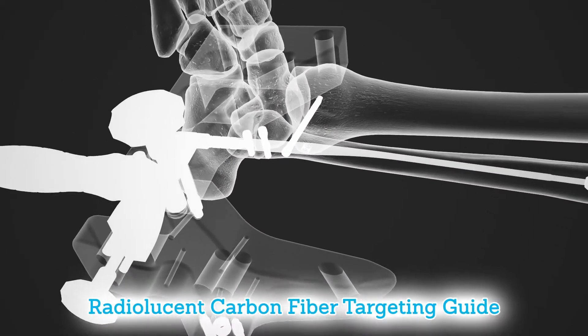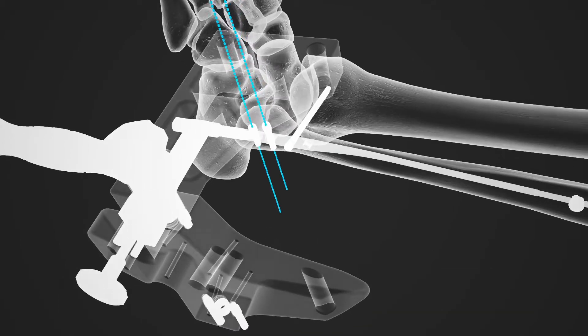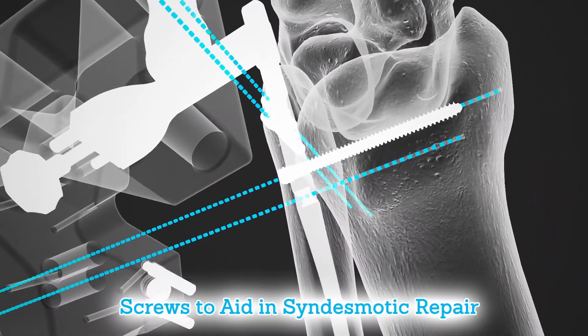The radiolucent carbon fiber targeting guide in the system is designed to aid in proper placement of interlocking screws in the nail, including screws intended to aid in syndesmotic repair.